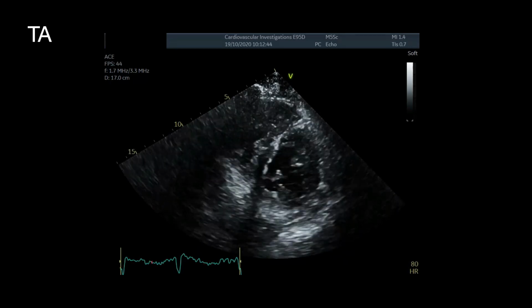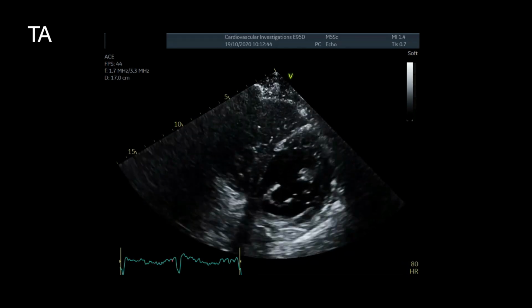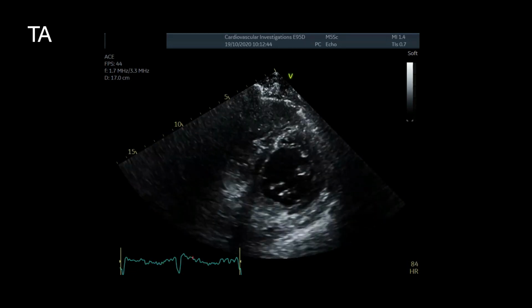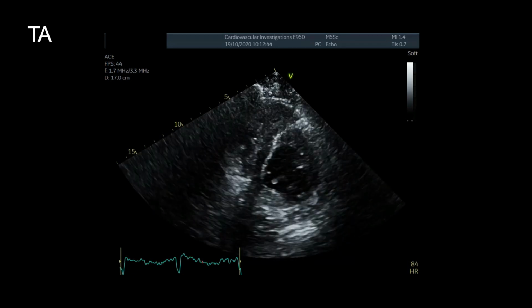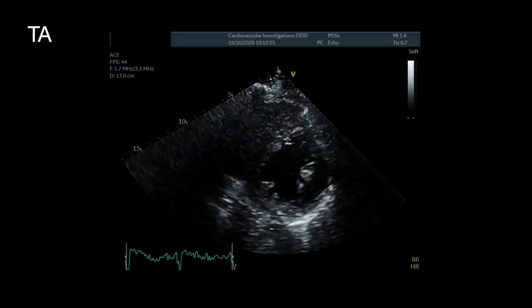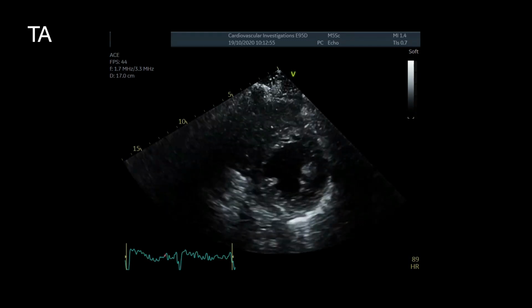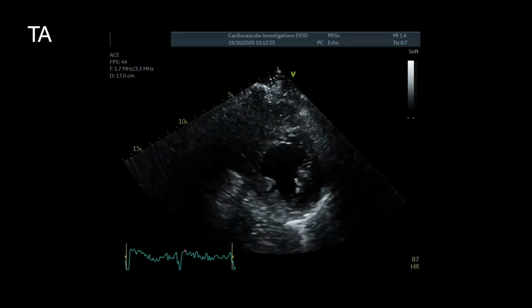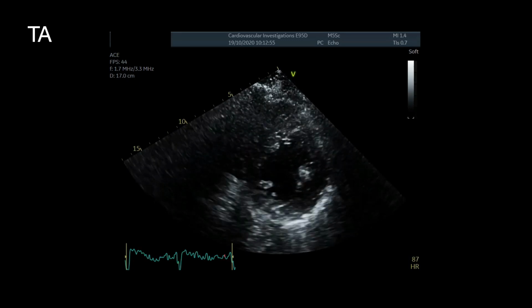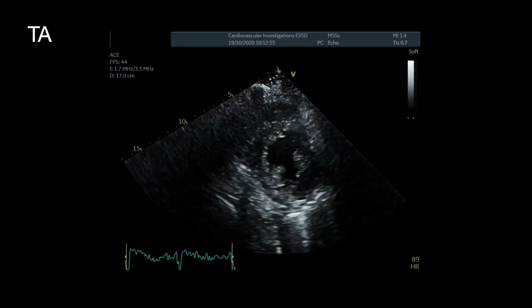And now we've moved down to the mitral valve level in the parasternal short axis view, and you can see septal flattening, I think, throughout the cardiac cycle and an enlarged RV. Move down further to the pap muscle. There is a D-shaped septum. It's a bit less convincing that it's throughout the cardiac cycle in this loop, so we'd have to slow that down and have a look.